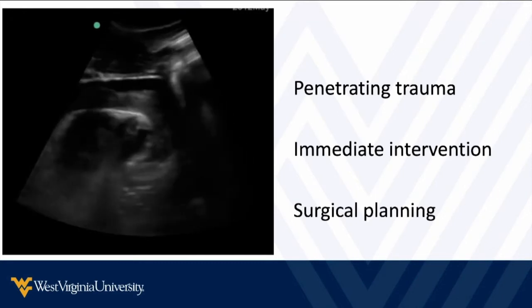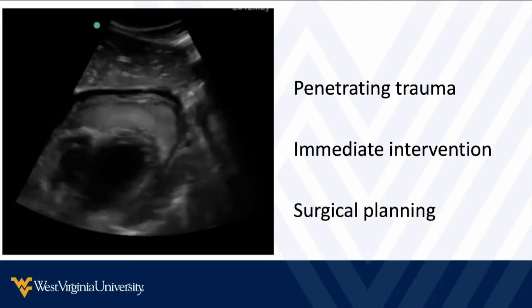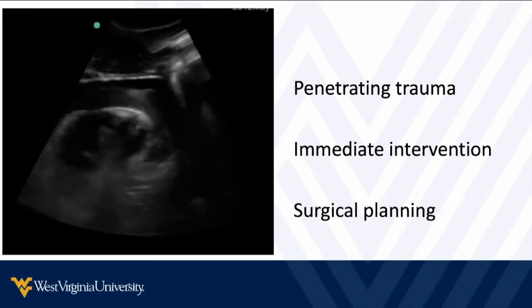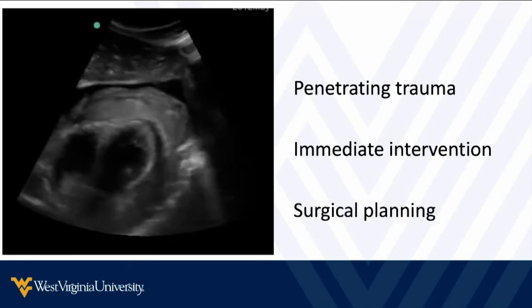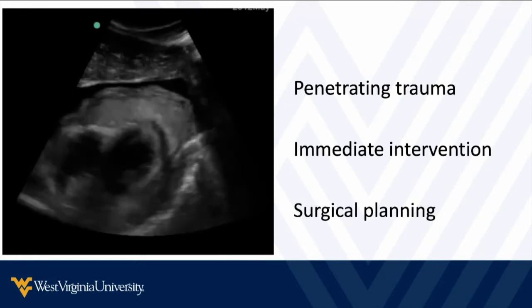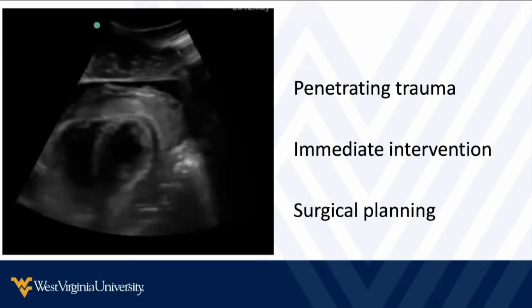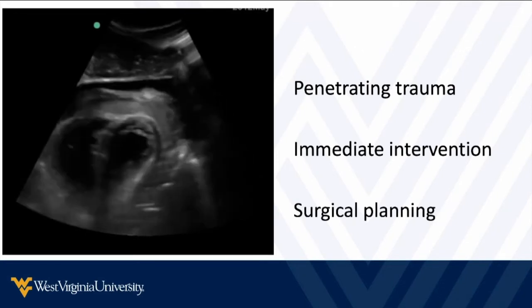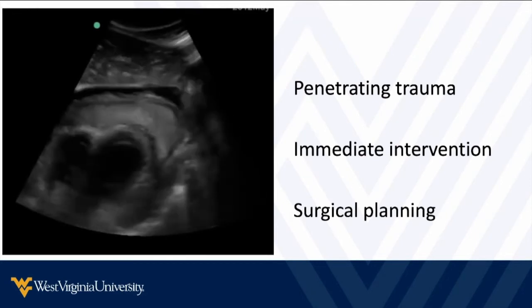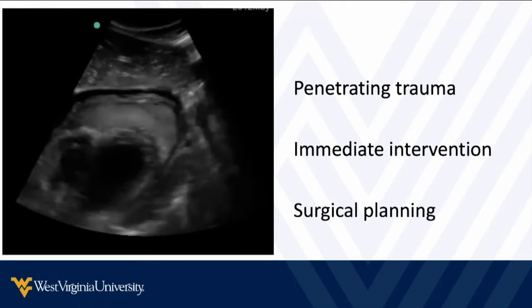And in some studies, what's been demonstrated is if there's penetrating trauma with no pericardial effusion and no cardiac activity on arrival, the likelihood of survival is incredibly low. Now, I'm not going to say you should decide to begin resuscitation or not based on that, but that's something that's been suggested in some of the trauma literature. Certainly, if there's pericardial tamponade from trauma and we can address that, then we increase our patient's odds of survival, again, depending on our scenario and our setting and what resources we have. So just think it's important to recognize the role for FAST exam and ultrasound in trauma, even in penetrating trauma.